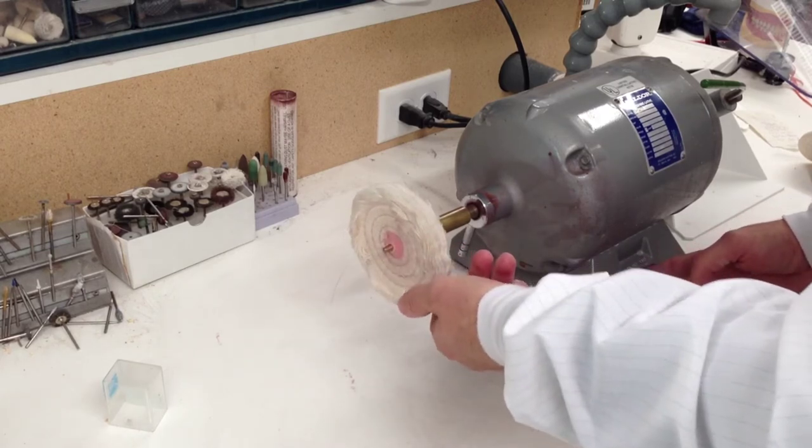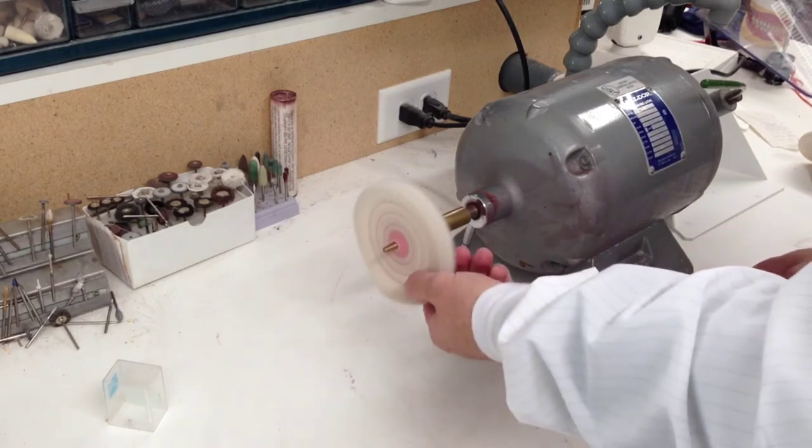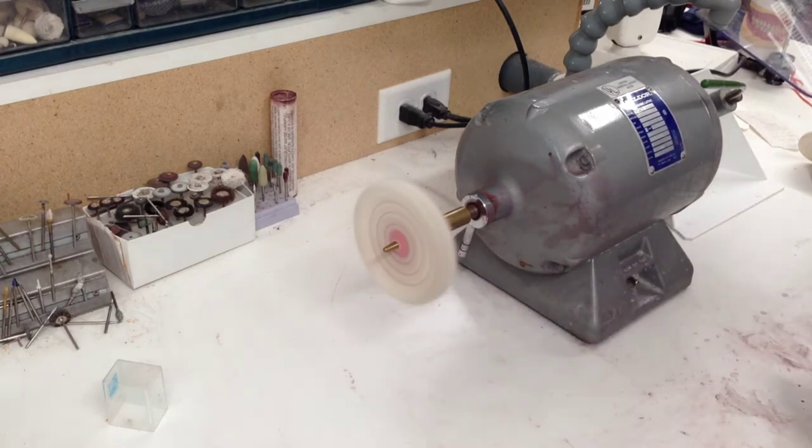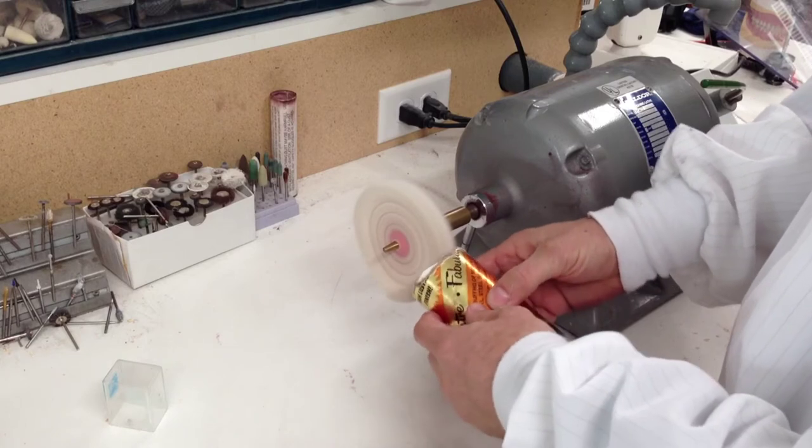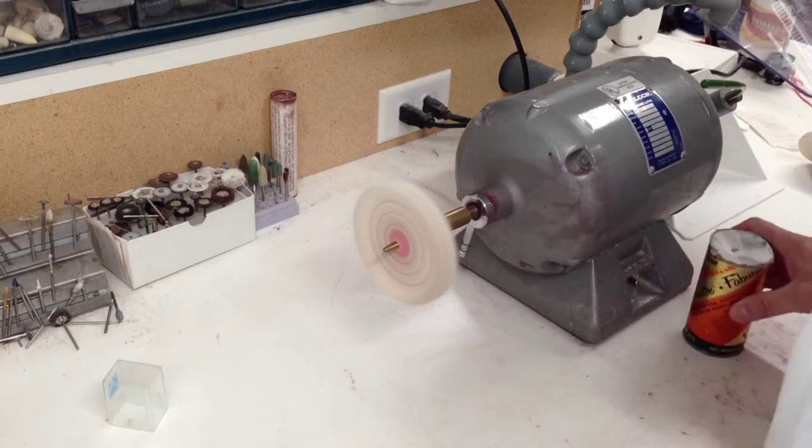You don't have to push very hard; turn the lathe on and it will tighten up on its own. Apply the Fabulustre, run your wheel through it, and at that point you can polish up any of your acrylics.